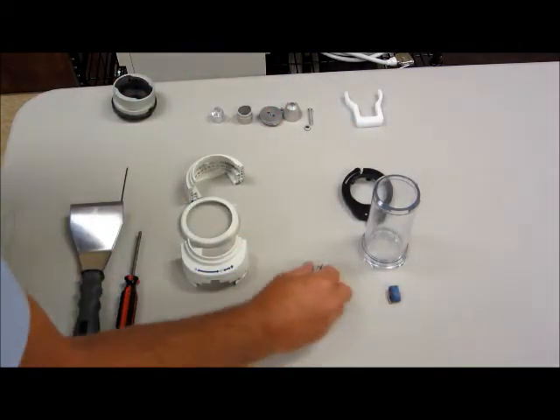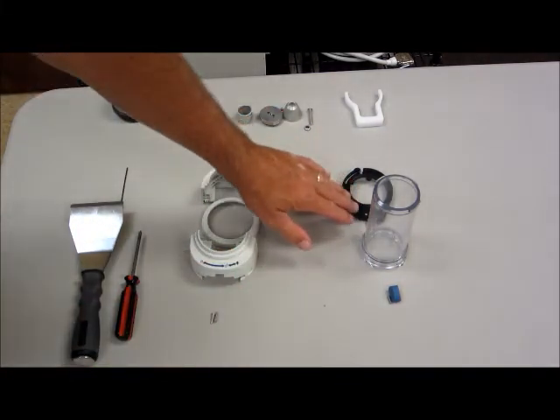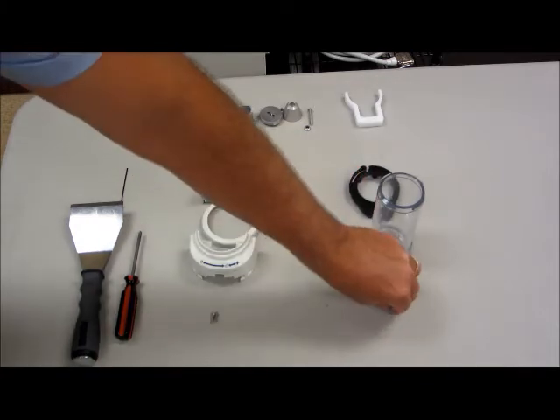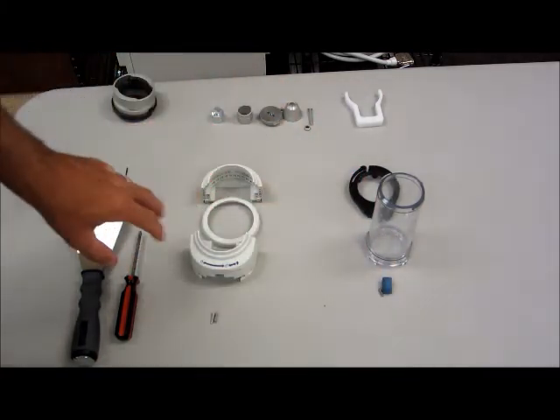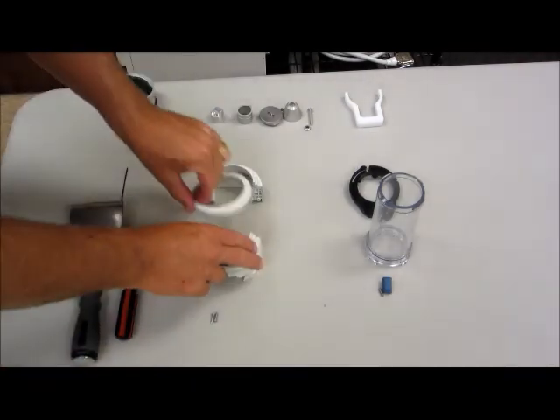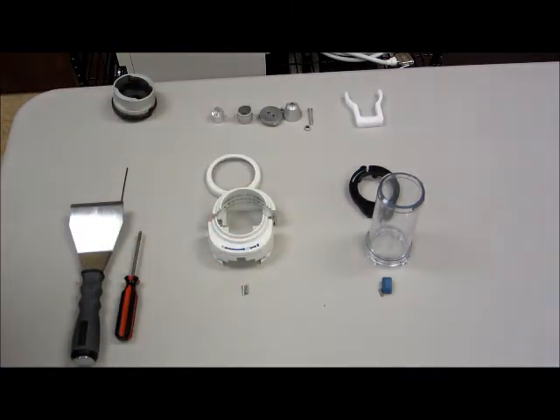At this point you will store these components. These are the OEM components that can be used to restore the injector and this faceplate back to its original condition. The two halves, the trim ring, and these two screws we will utilize as we continue the installation.